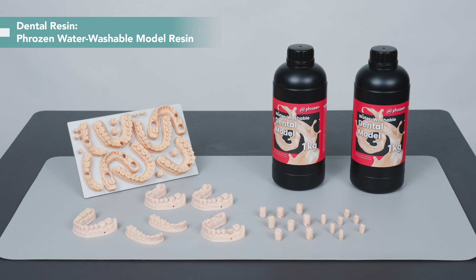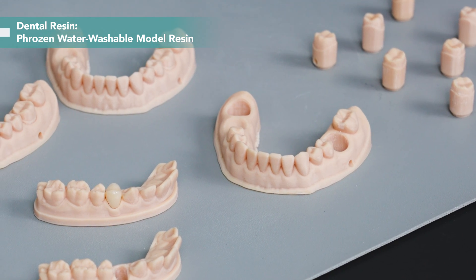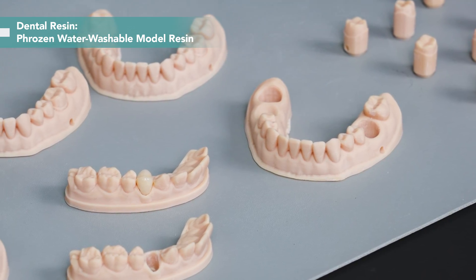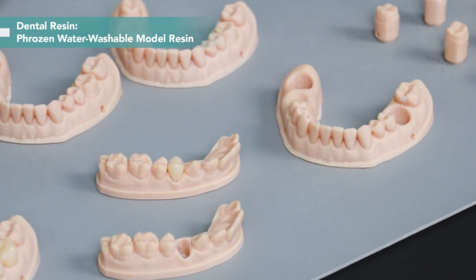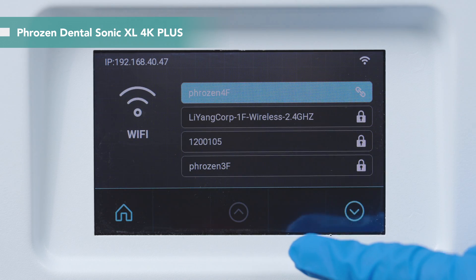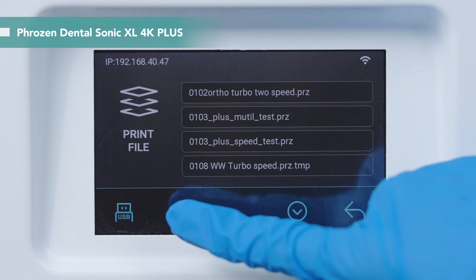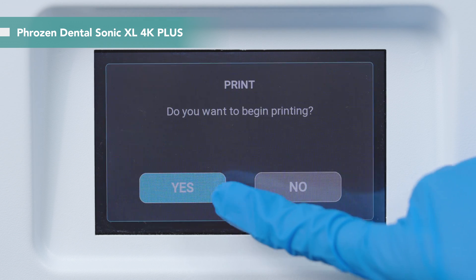For printing the removable die model case, we use Frozen water washable dental model resin. Its print results show over 90% variation within 0.05 mm tolerance compared to the original CAD files — this precision makes it perfect for crafting highly accurate crown and bridge models. Give the resin bottle a good shake before use. You can import the printing files to the printer via USB or Wi-Fi. We use USB today. Now everything's ready — let's print!